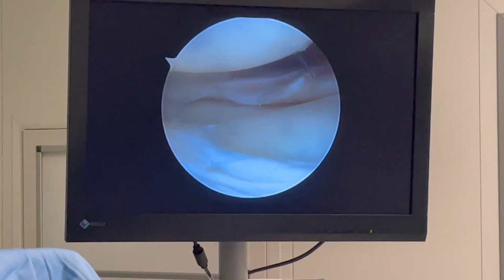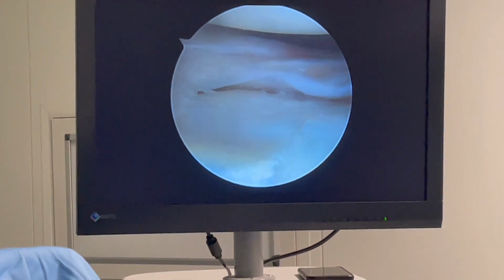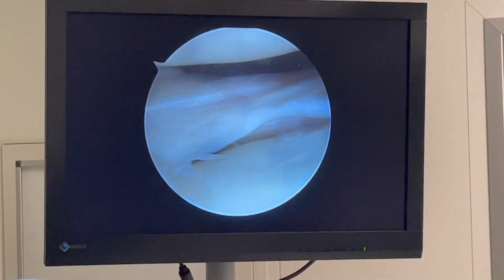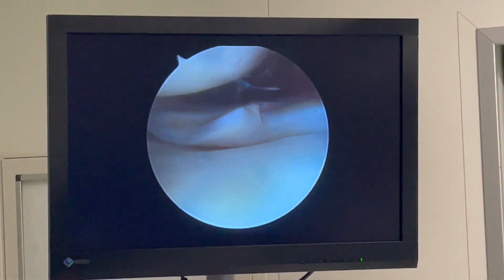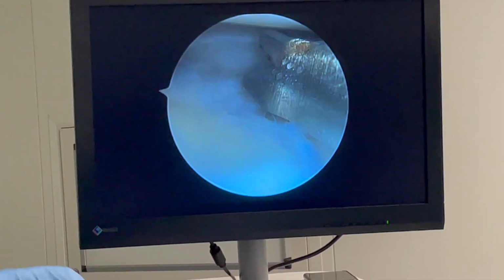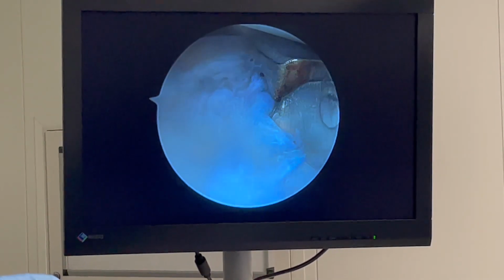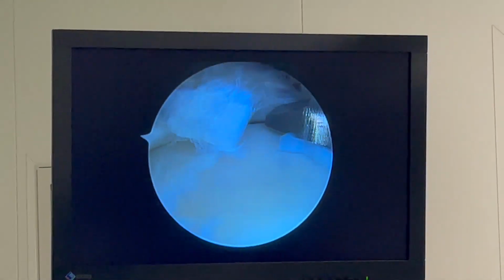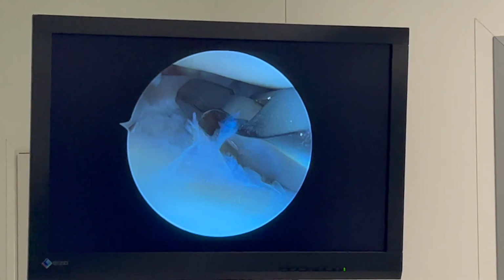This is the lateral meniscus. And this is lateral meniscus, right? With the tear. Lateral meniscus. Tear. So these are the tears, small tears, right? Make a cut open. Mohammed, can you see now we are cutting the edge? Trimming it. Yeah, we are trimming the broken part. That's the avascular part. Yeah, that is the white zone of the meniscus.